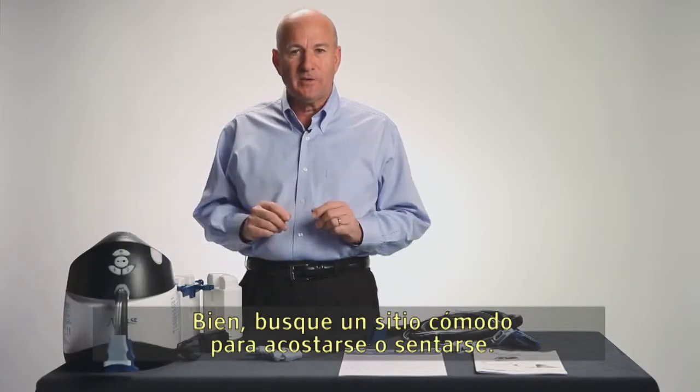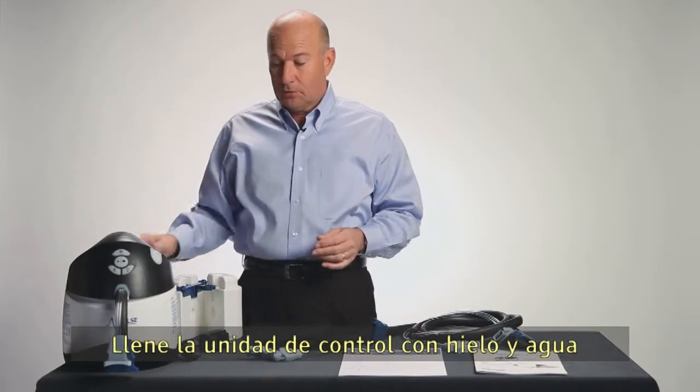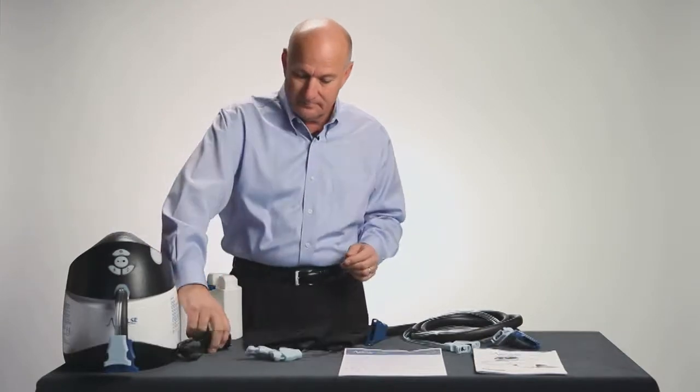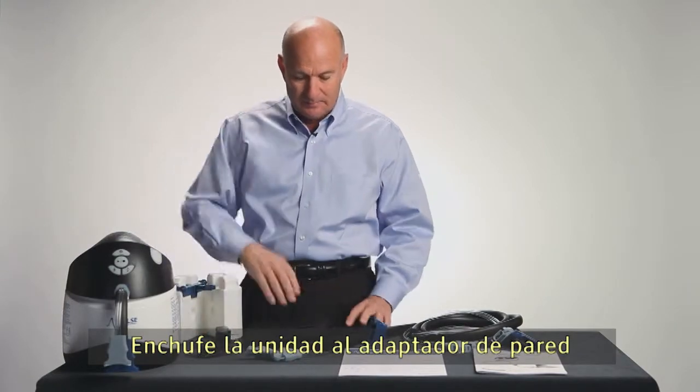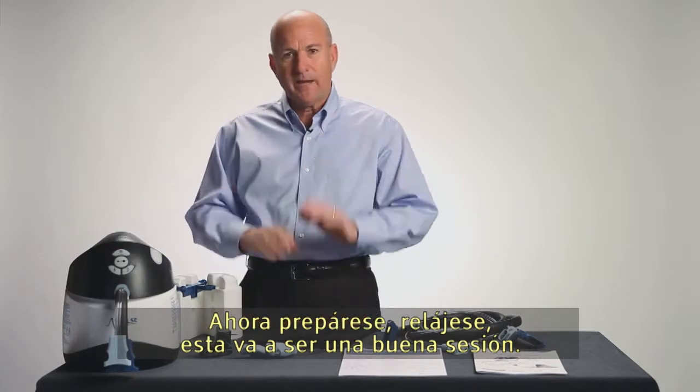Find a comfortable place to either lie down or sit down. Fill the control unit with ice and water, plug in your wall adapter, secure your calf wraps, and attach your tubing. Now get ready — relax, this is going to be a good session.